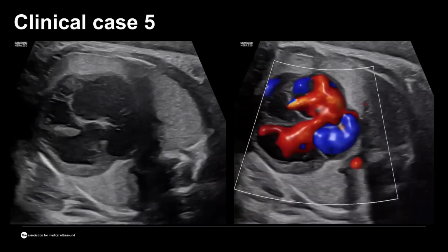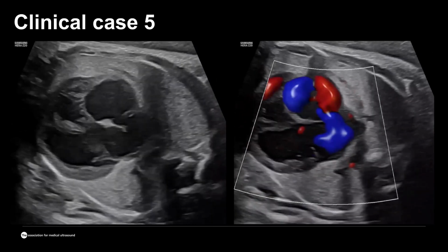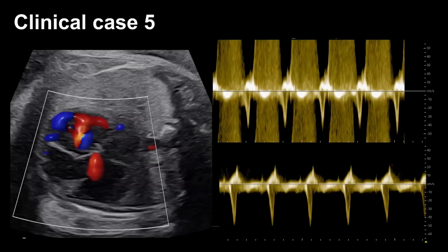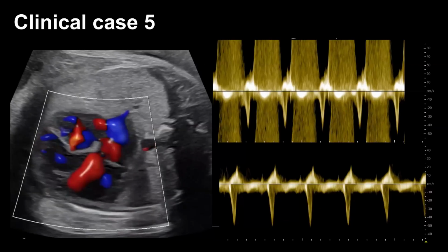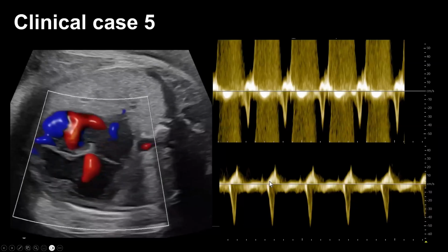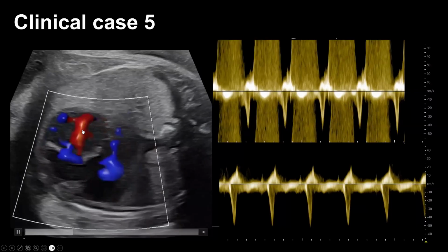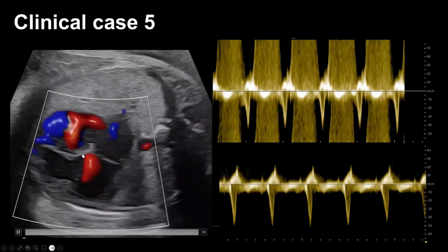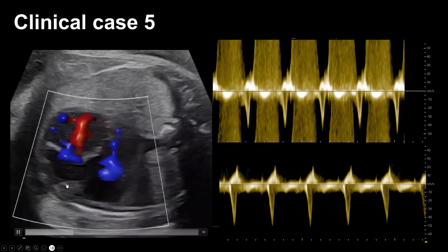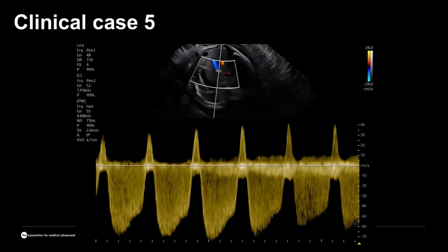But this is a little bit trickier case. Looking at this heart, you can see that it has an abnormal shape, but you can't really see any anomalies per se. What this heart has is severe myocardial dysfunction. And how can we judge that? We are looking at the monophasic flow through both AV valves, and the significant tricuspid regurgitation indicates that this is a biventricular myocardial problem. We don't know what's causing that. So this was a really interesting observation.